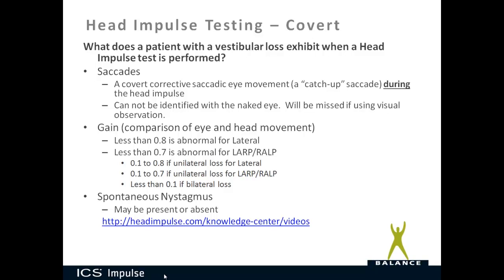A covert catch-up saccade is a corrective saccadic eye movement that happens during the head impulse itself — the eyes move away from the fixation dot but return to it before the head impulse stops. These cannot be identified with the naked eye; they're missed by visual observation and were originally found using scleral search coil data. The gain thresholds are the same as overt: less than 0.8 for lateral and less than 0.7 for LARP and RALP is abnormal. Less than 0.1 is typical of bilateral loss.